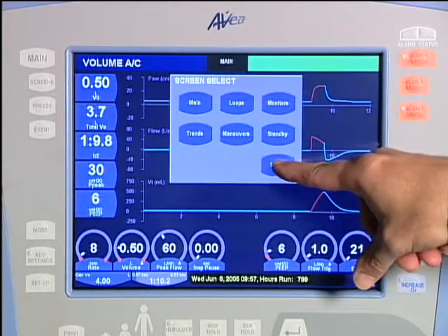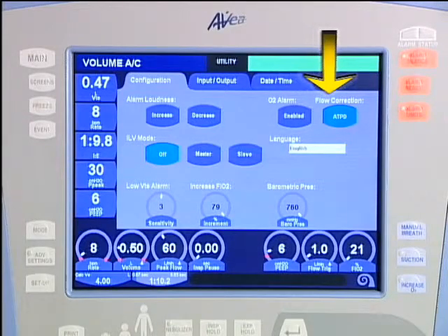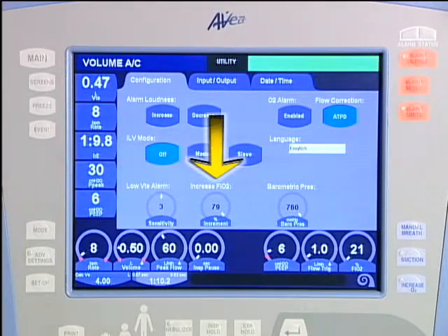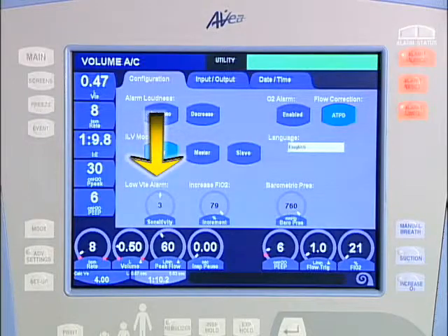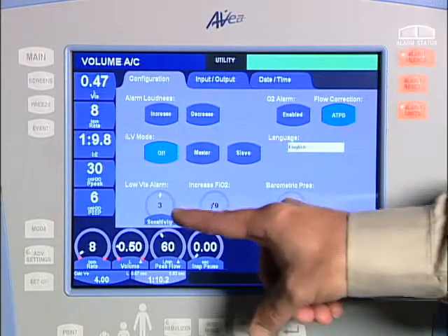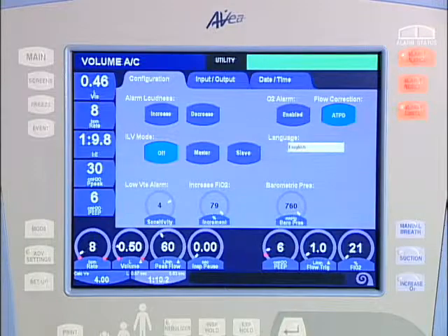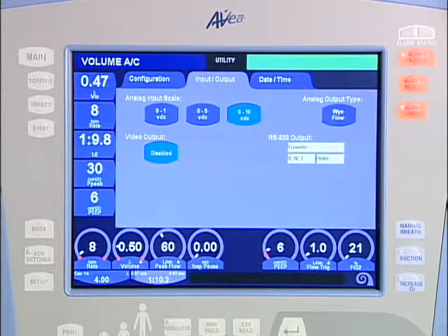The utility screen permits configuration changes such as alarm loudness, enabling or disabling the O2 alarm, flow corrections for heated humidified gas, independent lung ventilation, barometric pressure, and language. The increase O2 feature, activated by the increase O2 membrane button, can be configured to any percent increase desired. The low exhaled tidal volume alarm, whose limit value is set in the alarm limit screen, has a sensitivity setting in the utility screen. Set the number of consecutive breaths that can occur below the alarm limit before the audible and visual alarms are activated. Tabs enable the display of additional utility screens to configure input-output devices and change the current date and time.